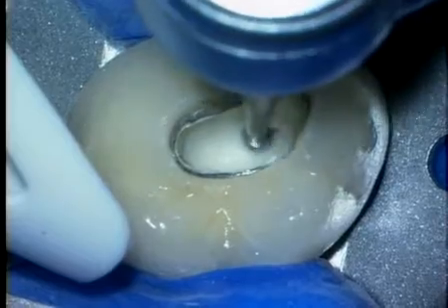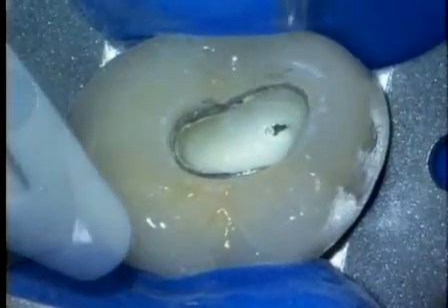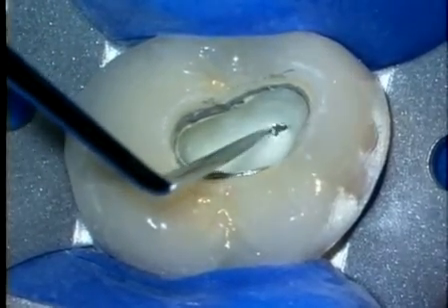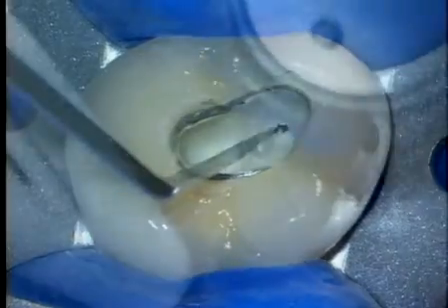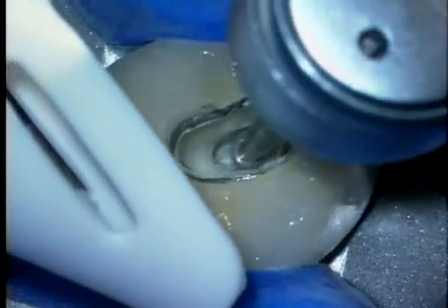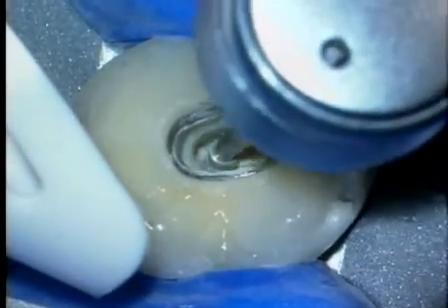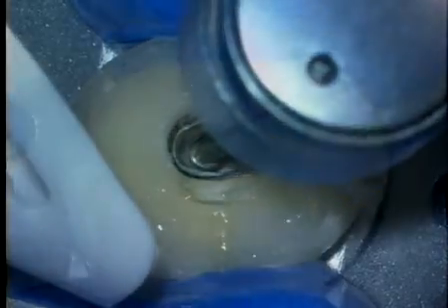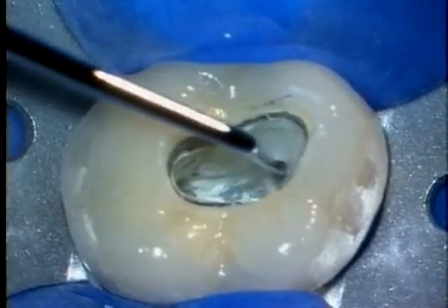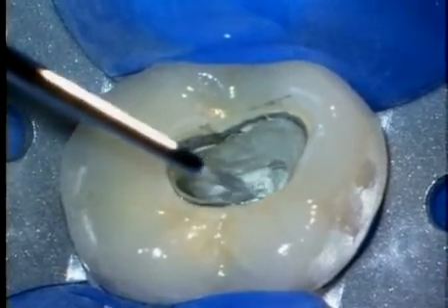At a higher magnification, you can see that we've just broken through the pulpal roof towards the MB. The explorer demonstrates the initial entry into the pulp chamber. This site is where we'll place the number 4 surgical length round burr. We drag up, and as we lift the head of the burr up, we de-roof the pulp chamber progressively, and we continue this until the roof is completely removed. Notice this leathery tissue that's occupying a portion of the pulpal floor.